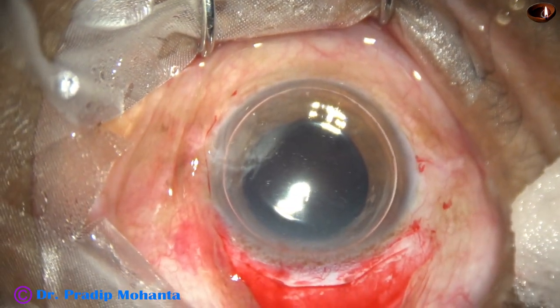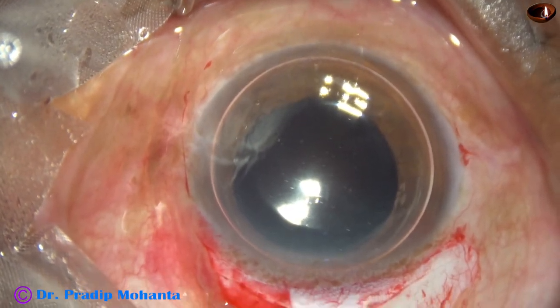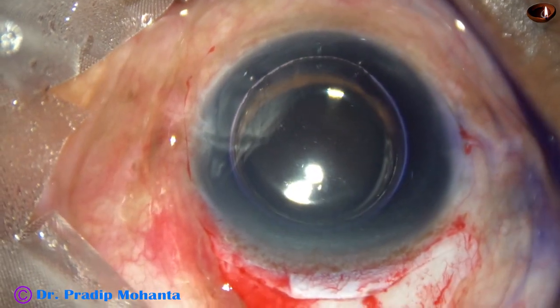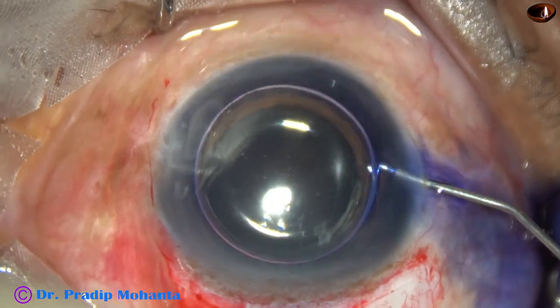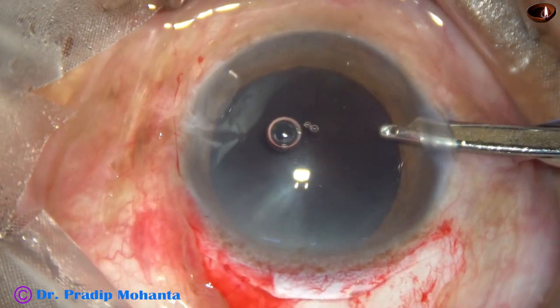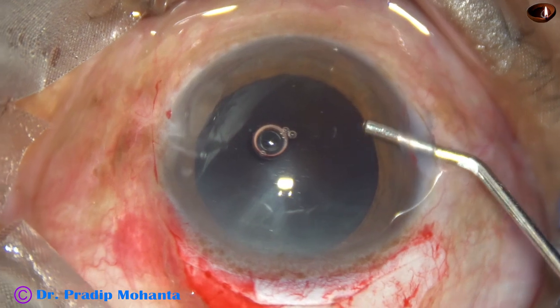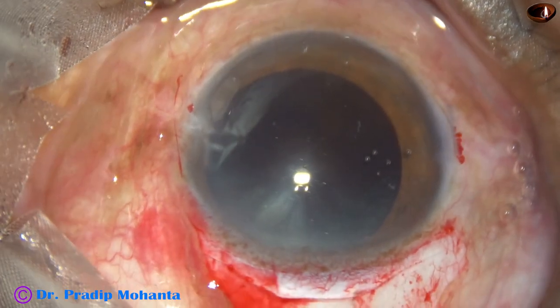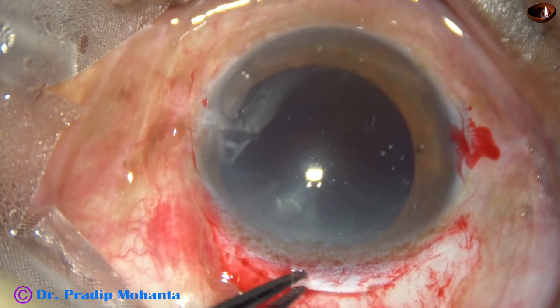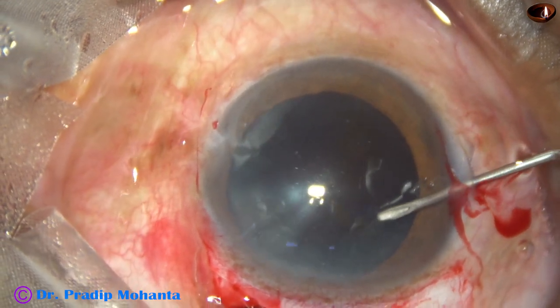The anterior capsule is being stained with trypan blue dye. We had no dye in the late 90s. Now we have it. This helps in doing capsulorhexis. We used to do can opener capsulotomy in 94, 95, 96, when I used to do ECCE. Nowadays, we do capsulorhexis and place the lens in the bag. At that time, we had no idea where the lens goes. It may be in the sulcus. One haptic may be in the bag, another in the sulcus, or both haptics in the bag or sulcus, we didn't bother. We used to put a large PMMA intraocular lens just under the iris. But we had very good results because we used to put very beautiful, meticulous sutures.